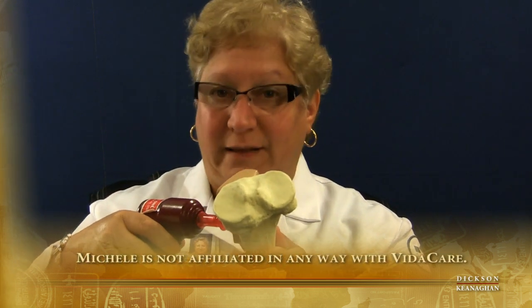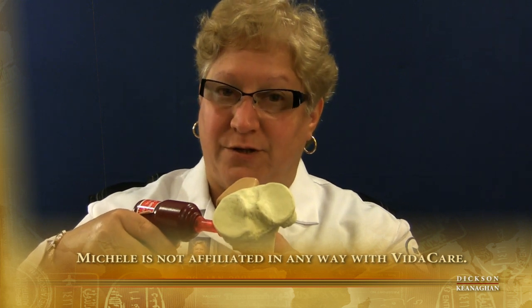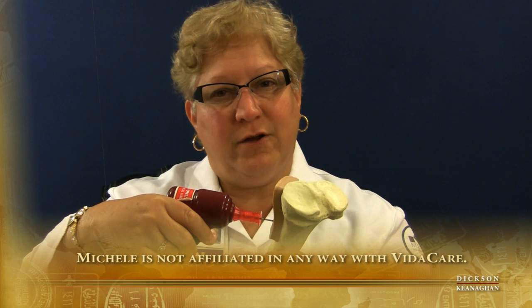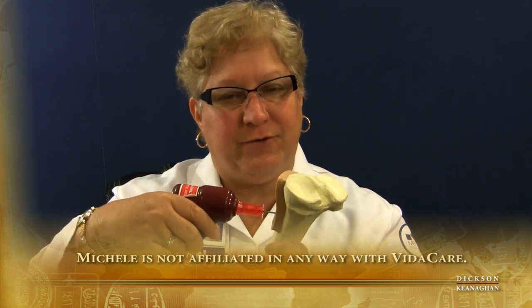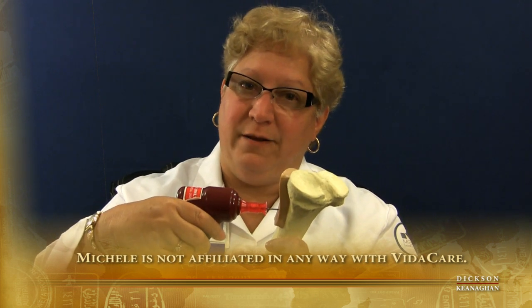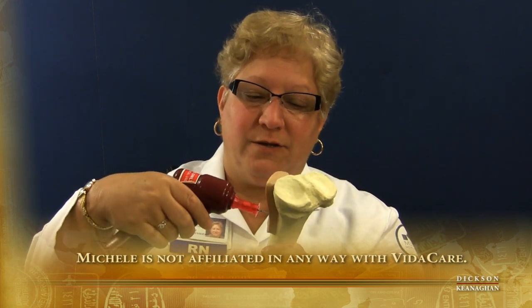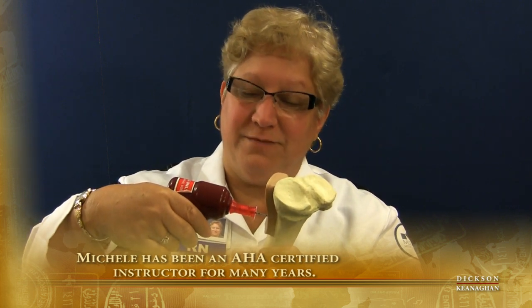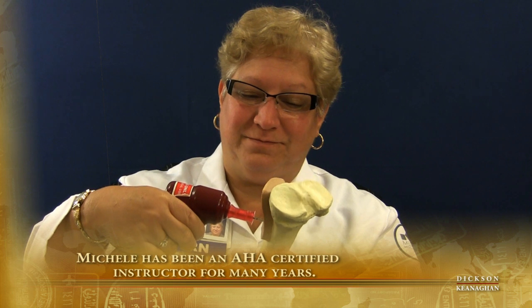Now certainly the patient's bone and leg would be on a table or stretcher, but just for demonstration purposes, you'll see they don't really need to put a lot of pressure on the drill. They don't recommend a lot of pressure because you put some drain on the battery. So it's going straight in to the bone with a consistent, light pressure until the needle is into the marrow and you feel a release. So here we go — it's in.